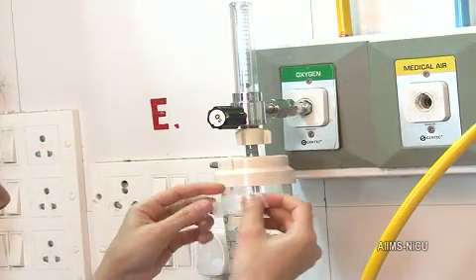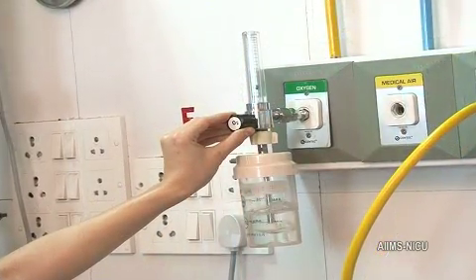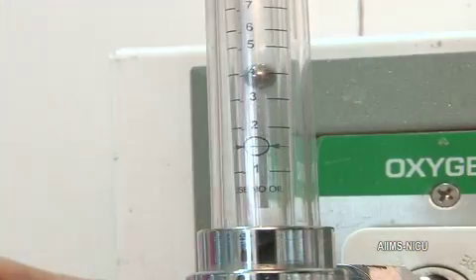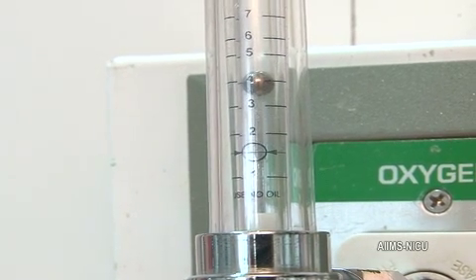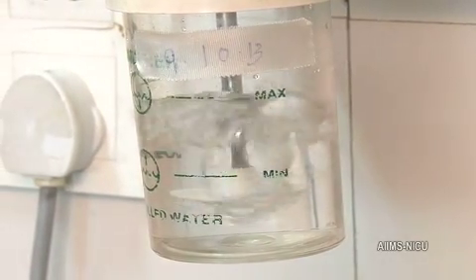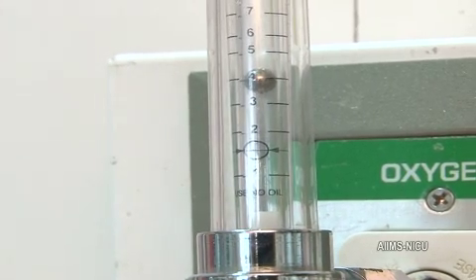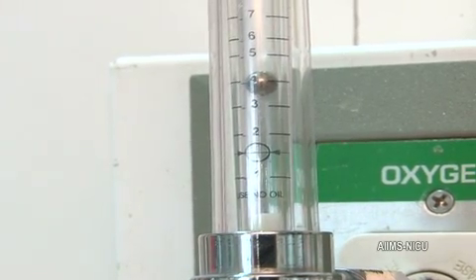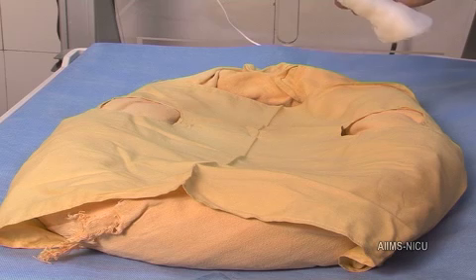Set the flow rate. Here, we shall learn about the administration of oxygen by hood. The flow rate is set 3 to 5 liters per minute. Observe if the bubbles are coming out in the humidification chamber. Remember, the flow rate should generally not be less than 2 liters per minute while administering oxygen by hood.